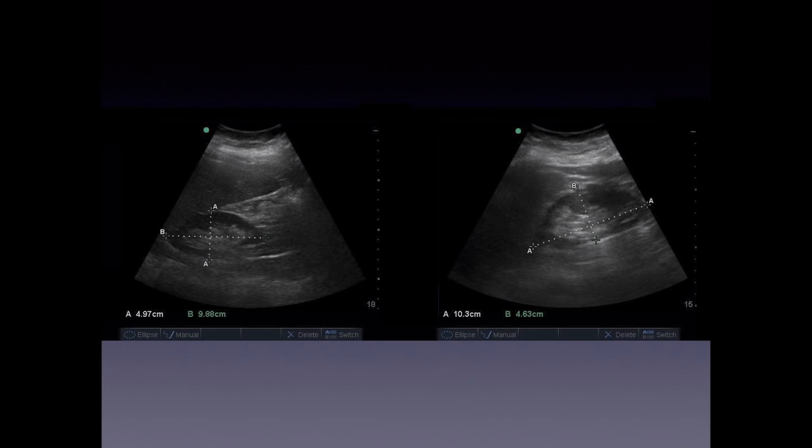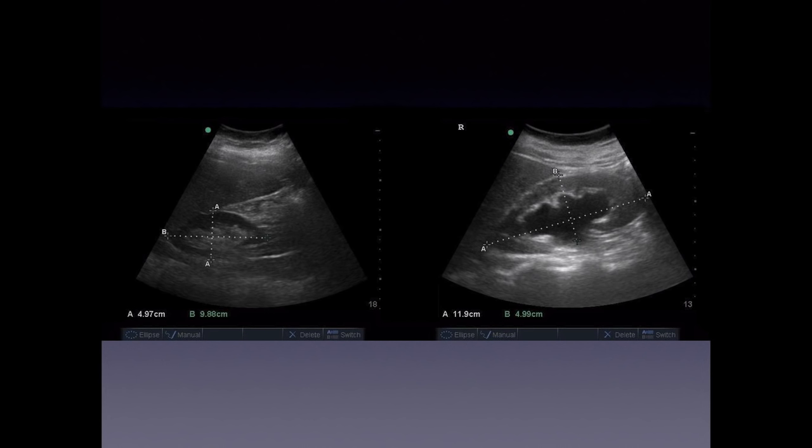When comparing both sides, this is an example where obviously the right side has hydronephrosis present compared to the left side — demonstrating how comparing the two kidneys helps identify pathology.